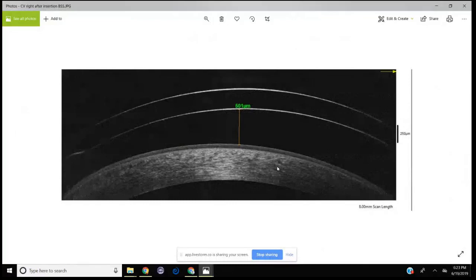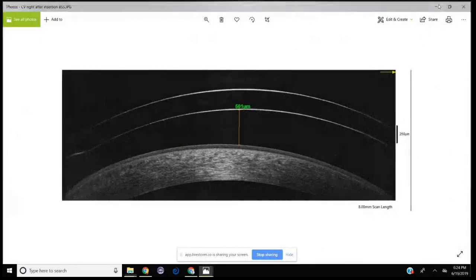So what do I do? I ordered the lens. I took off 200 microns. So at least at insertion, I can assume I have 300 microns of vault centrally. And I let it settle. How did it look after the lens was ordered, given the Eaglet data straight through from the Eaglet?